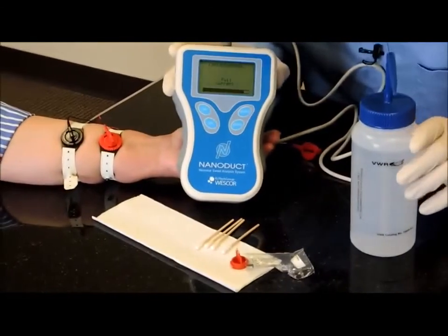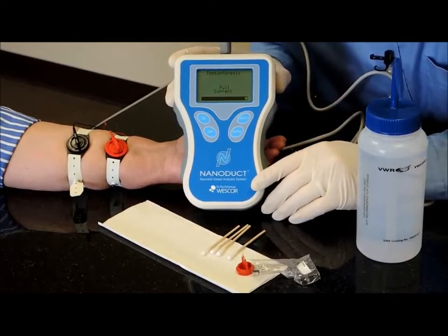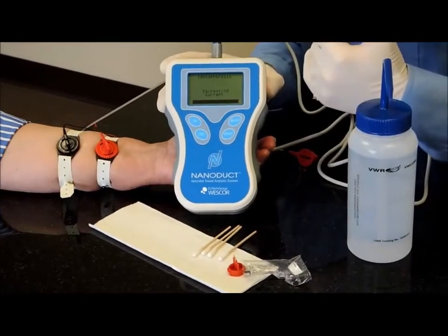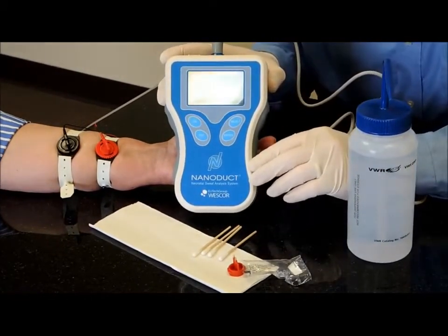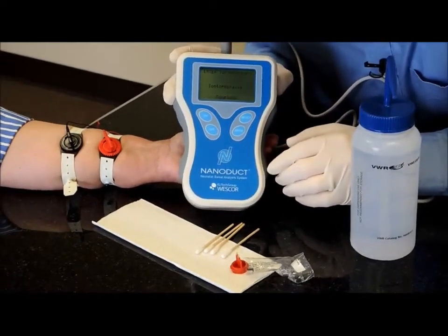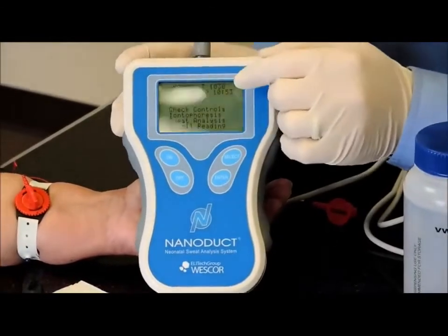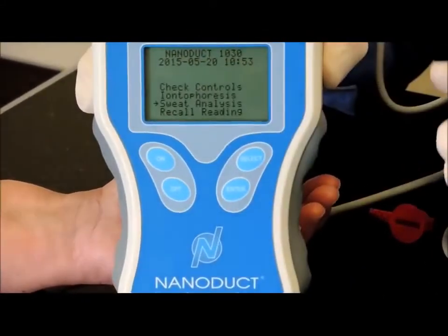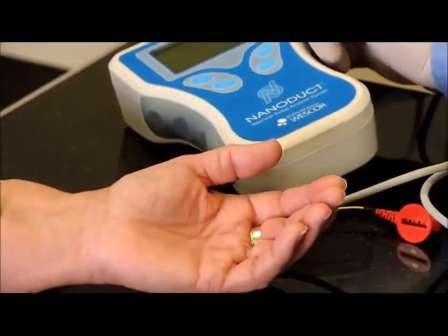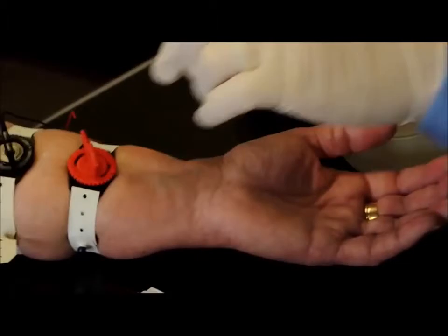You can see the iontophoresis progress bar is almost complete. And at completion, it will say decreasing current, and then you'll go back to the main screen. Okay, so it says iontophoresis complete. Press enter to continue. So I press enter, and now we're back at the main screen with the arrow pointing towards the sweat test. So at this point now I'll put the Nanoduct down, and I'll remove the red electrode only. Only the red electrode.